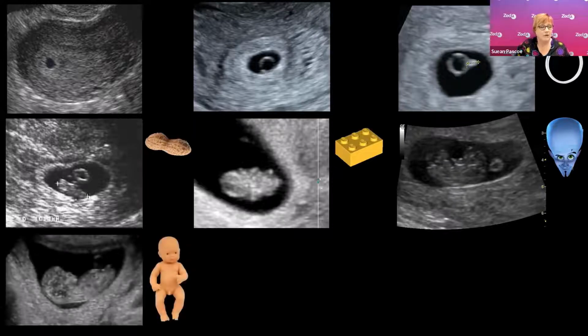By the time the embryo is 10 weeks, you can see definitive human features. And this is when we can tell the difference between a human embryo versus an elephant embryo versus a puppy dog embryo. Up until that point, we all look the same. All mammals look the same. But at 10 weeks, we can start to see this one is human.